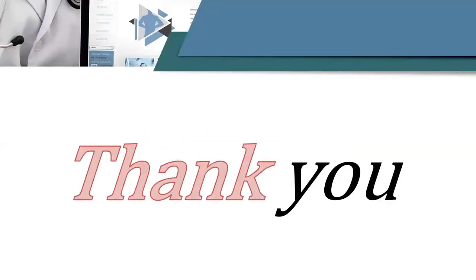Thank you, Dr. Pankaj. We do have a couple questions, and it looks like you answered one. The first one was, can we use film when using CR or DR? I saw that in your video. If you'd like to expand on that, please. Yes, actually, we can use the film after erasing the previous X-ray which was taken. We can use that film again.